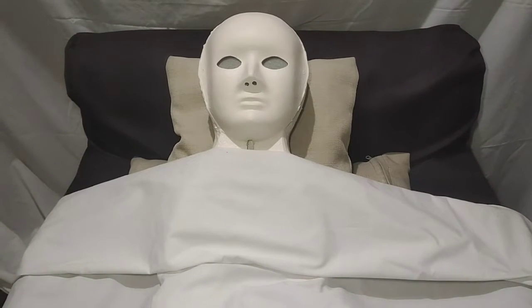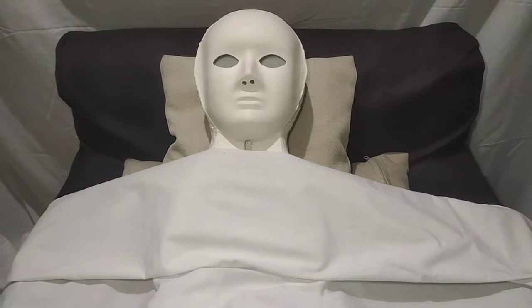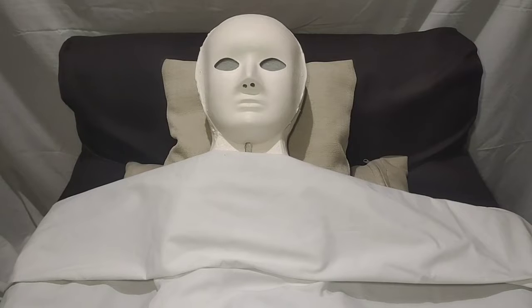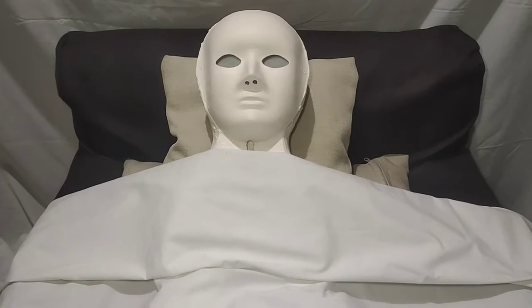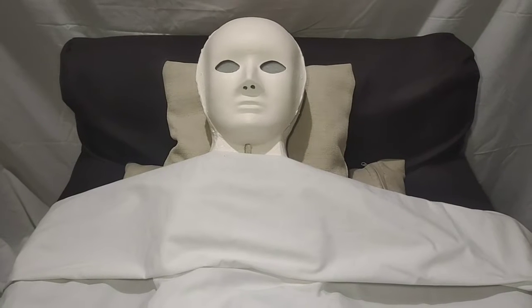Let us now proceed to the assessment of the procedure. First, we should assess the patency of the patient's nares by asking the patient to occlude one nostril and breathe normally through the other.